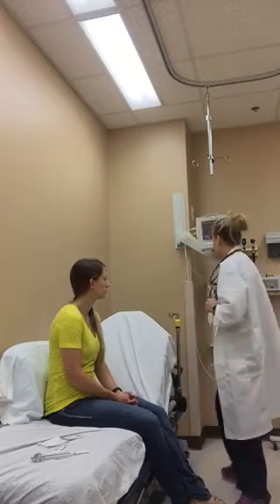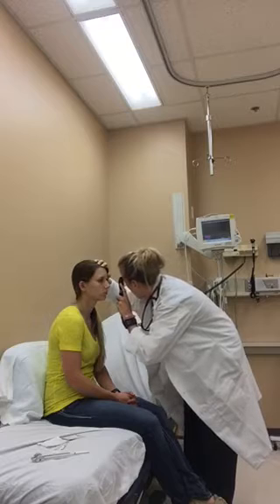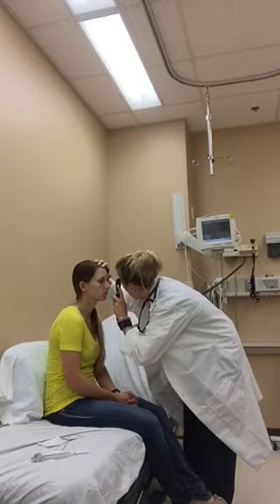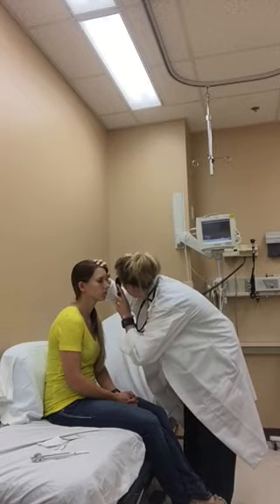So at this time, we'll go ahead and use the ophthalmoscope and look in the inner eye. I'm going to look at her left eye first. So I'm holding it in my left hand, and just look straight ahead. And this is kind of uncomfortable, so bear with me, okay? So I'm going to go through the lens, and I find the blood vessels. I'm going to look up to the medial, down, medial, up, lateral, down, lateral. And I was able to find the red reflex. The retinal color was a reddish orange. The blood vessels were intact, and the macula was also visible. So now I'll look at this other eye for the same things. And so I'll hold it in my right.